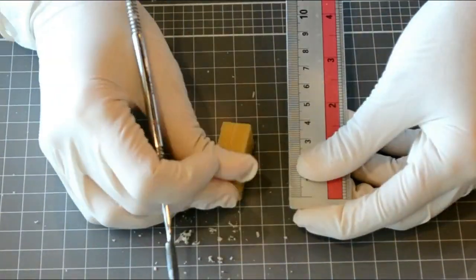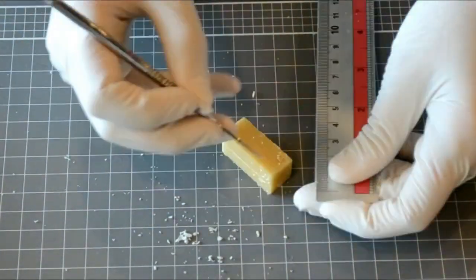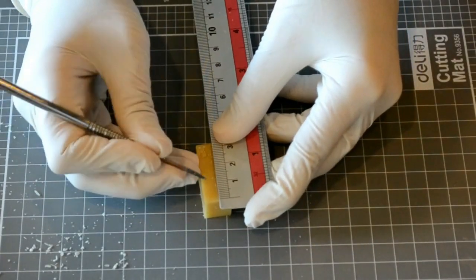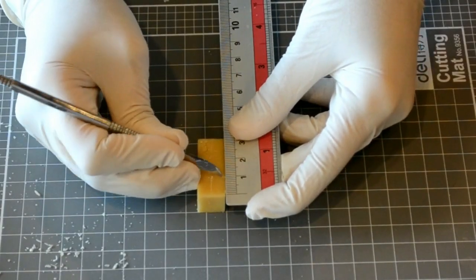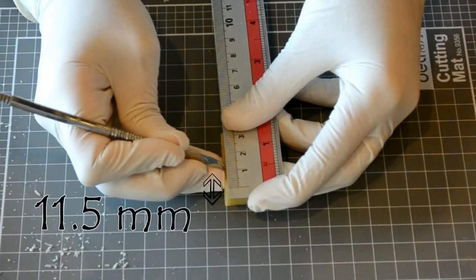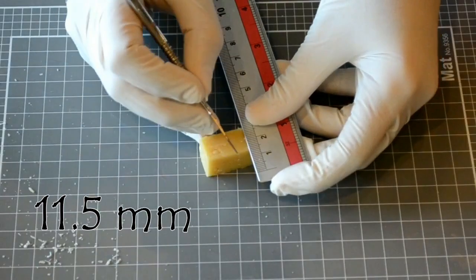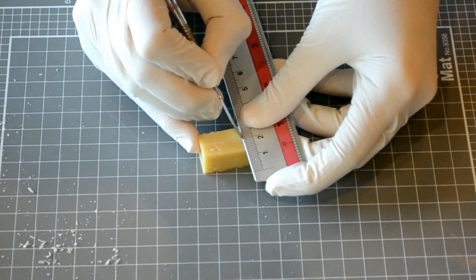Now you can start placing your measurements on each aspect using the lecron carver and ruler. Let's start with the buccal aspect. Using the incisal edge of the wax block as reference, measure 11.5 millimeters at the center of the buccal aspect to mark the length of the tooth.